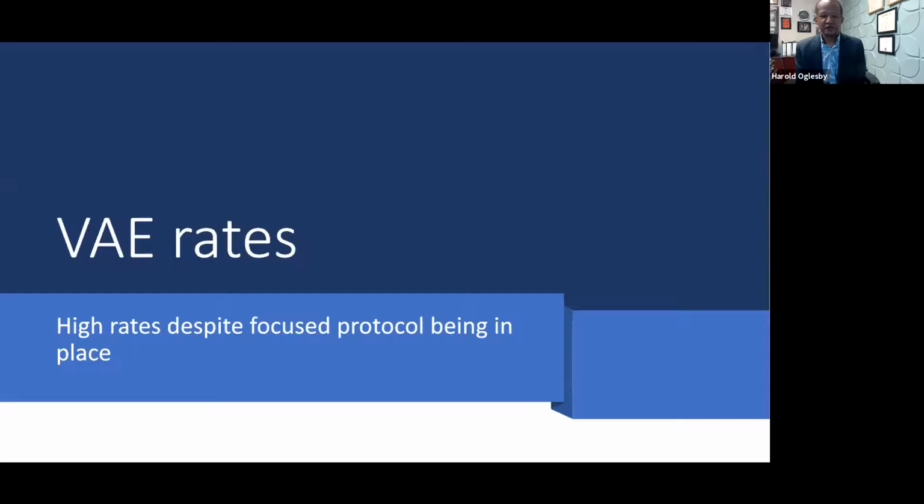So the next thing I said, should we have computers in every room in our ICU? They couldn't get to the computers in the room frequently because other care members were using those computers in those rooms. So we elected to move to the tablet model so that we can give the therapist something small, easily portable, that they could carry with them throughout their day that would allow them to review the data on a more frequent basis, and particularly as they were doing their rounds and at the bedside.